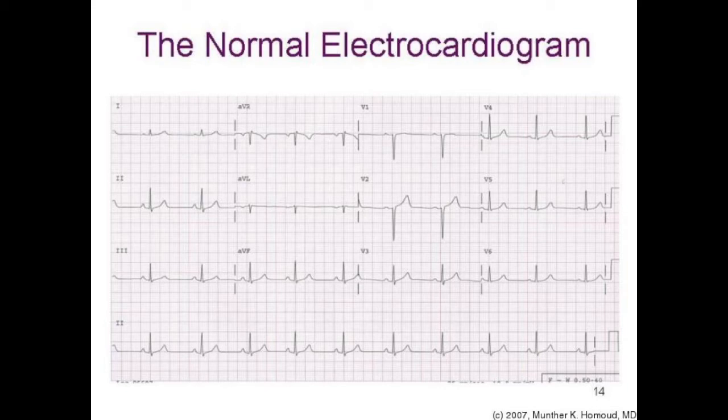A patient who has an ECG tracing from the 12 different leads that we mentioned earlier shows you 3 different beats represented here, 1, 2, 3, and depending on which lead you're looking at, the electrical activity appears in a different form. So we try to emphasize that people get used to what a normal ECG looks like, so that when there is a change from the normal electrical activity, you'll be able to pick it up and interpret abnormal findings in patients.